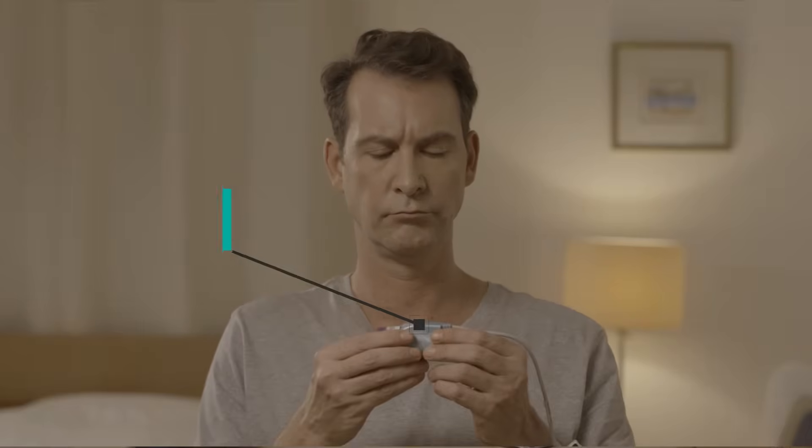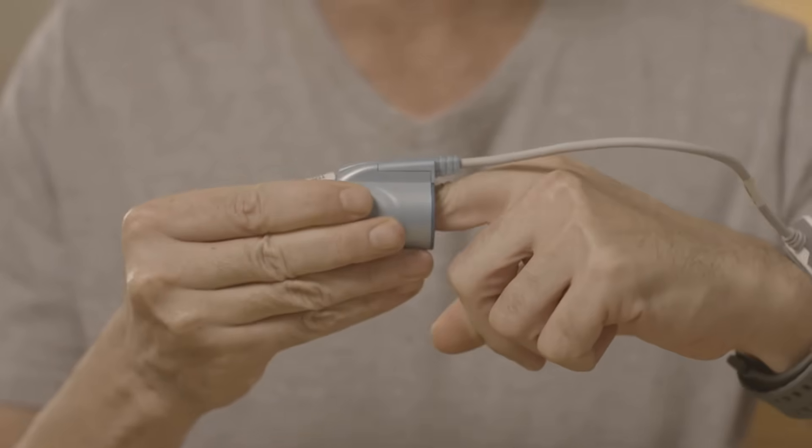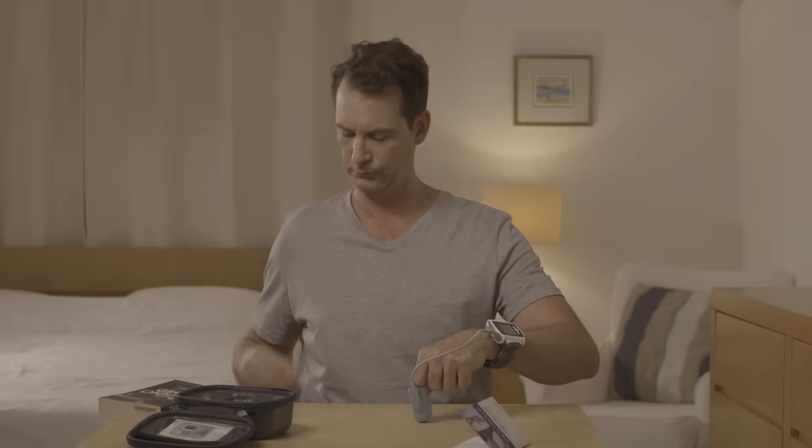Place the probe on the finger that you have been told to use, preferably the index or ring finger. It is normal to feel a little bit of pressure. Insert your finger all the way into the probe. The tab labeled 'top' should be situated on the top side of your finger. While pushing your finger against a surface, like a table or your leg, gently and firmly remove the tab. Be careful not to twist the probe.